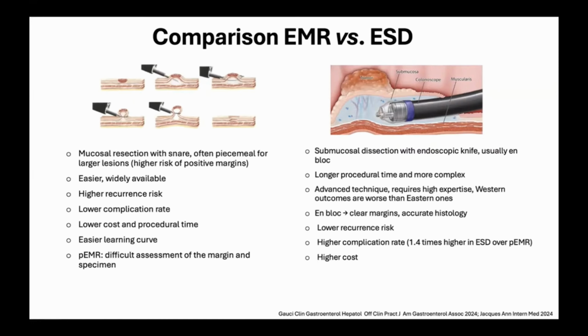In terms of surgery, ESD has been proven to be very safe, and the risk of surgery following a perforation is extremely small, less than 1%, far less than 1%, and it's when we're not able to close the defect endoscopically, which is very rare, or when we have a post-ESD perforation, which is a 0.5% risk.